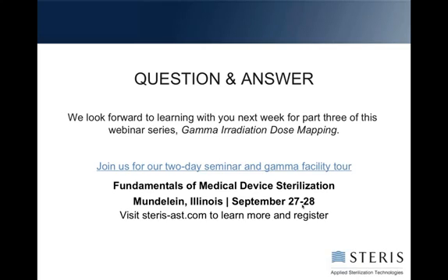All right, and last question. If your minimum is 25 kilogray, how do you develop the max then? Do you just keep testing at higher dosages to see if your product can withstand the dosage, or is there something else that needs to be performed? Okay, it is on some level trial and error, but the critical bit will be how much dose the plant that's processing your product needs in order to process it.